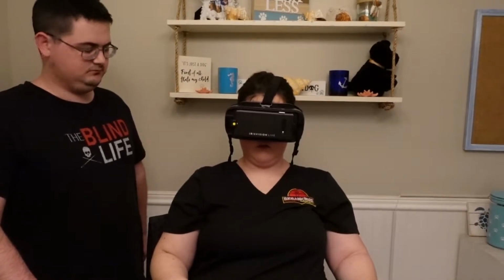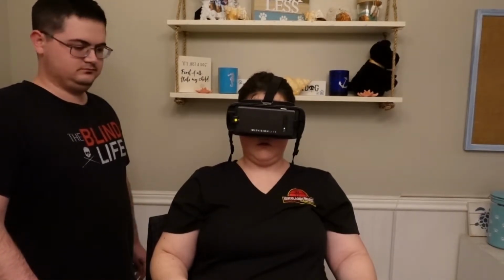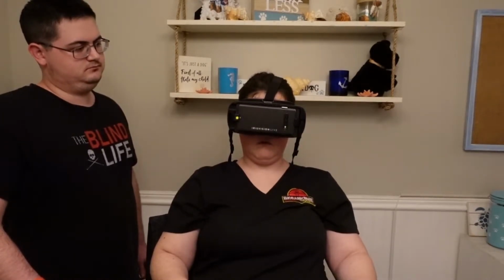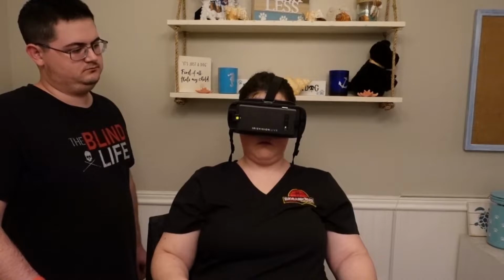Bioptic mode positions a viewfinder at the top center of the screen that allows you to magnify a specific section without losing the greater context of the view in front of you.